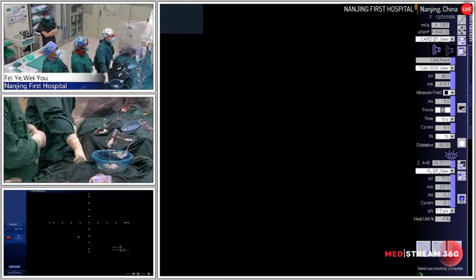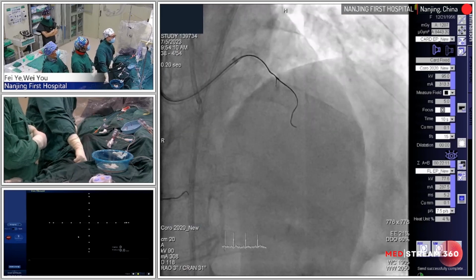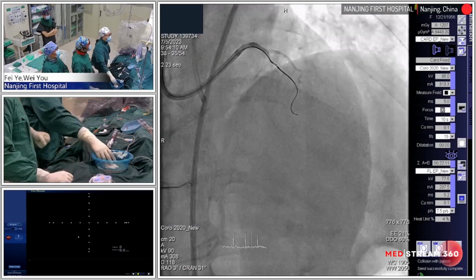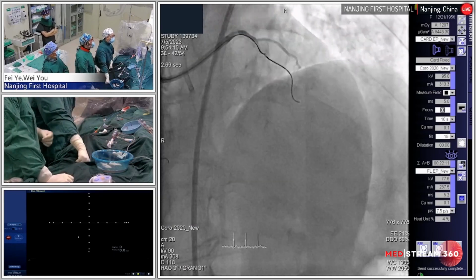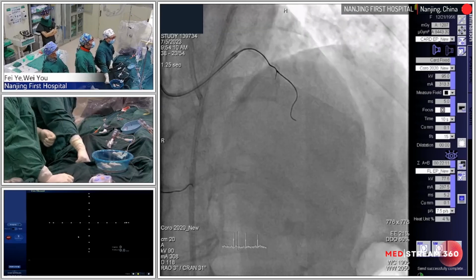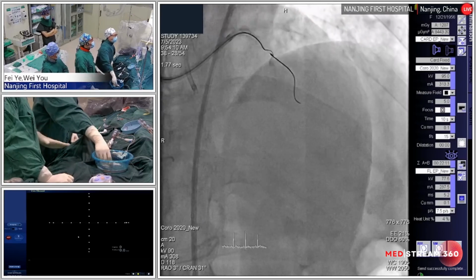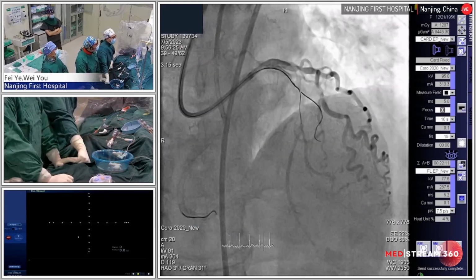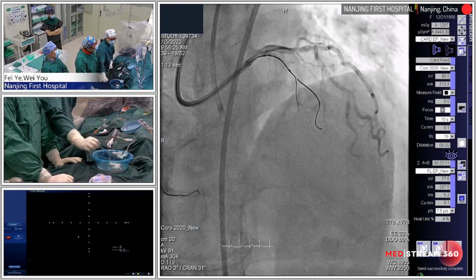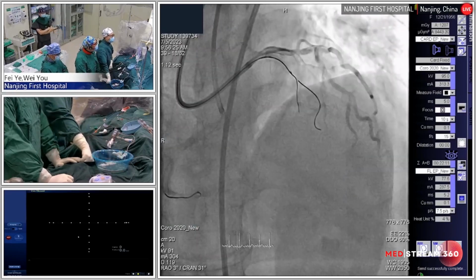So next, please. I try to use the double lumen catheter, the KDL, but you can see the softer tip wire, Fielder XT, cannot engage the ostial plaque. So next, please. I changed the guidewire to a middleweight tip load guidewire.